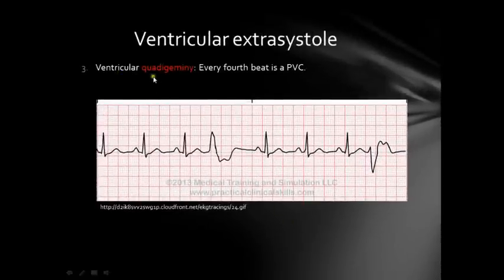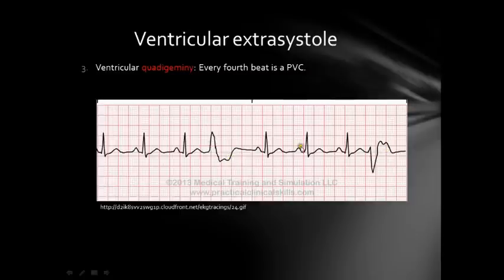Ventricular quadrigeminy means every fourth beat is a premature ventricular contraction: normal beat, normal beat, normal beat, ventricular extrasystole, repeating. You can also see here that this ECG strip is multifocal — this ventricular extrasystole looks different in morphology from this one — so we can call it multifocal ventricular quadrigeminy.